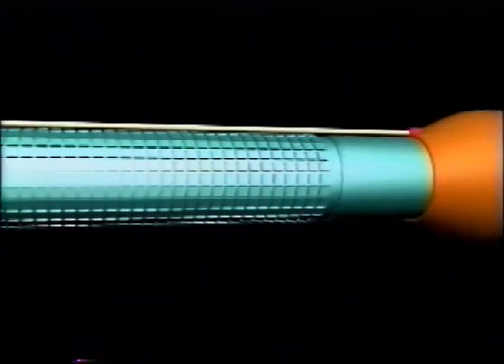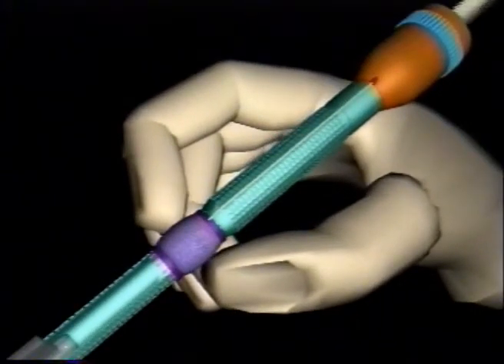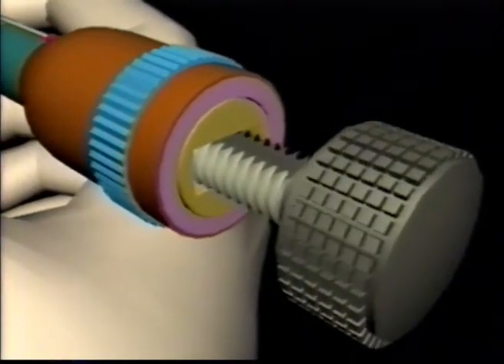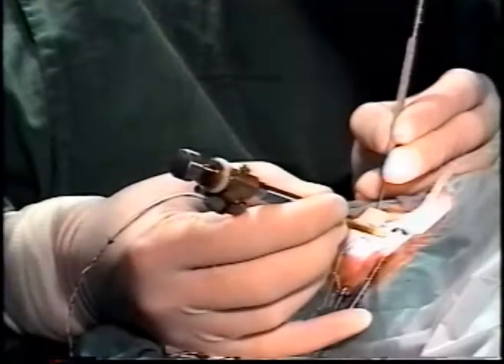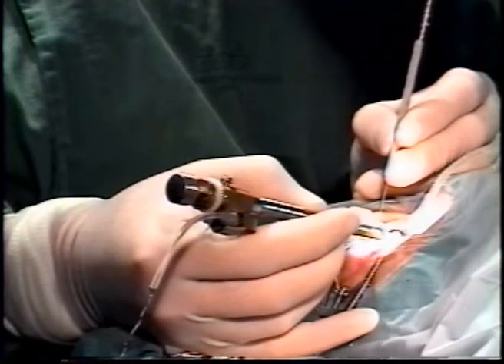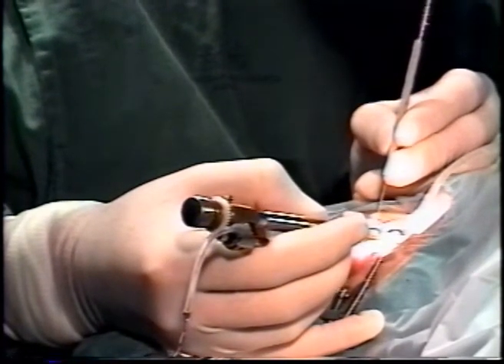Our challenge was to simplify the system to produce a practical device for a common surgical environment. Our initial idea was a spring-powered, mechanically operated system providing forward and backward plunger motion under operator control. However, we realized that developing a reliable, autoclavable, spring-powered mechanical system would be too complex and expensive to replace current bi-manual injectors. We learned from our electronic prototype that the main aspects for precise IOL injection are controlled speed and proper orientation, while injection force is irrelevant as its magnitude is negligible compared to the potential force of the operator's fingers. With these considerations, we refocused on developing a manually powered precision IOL injector.